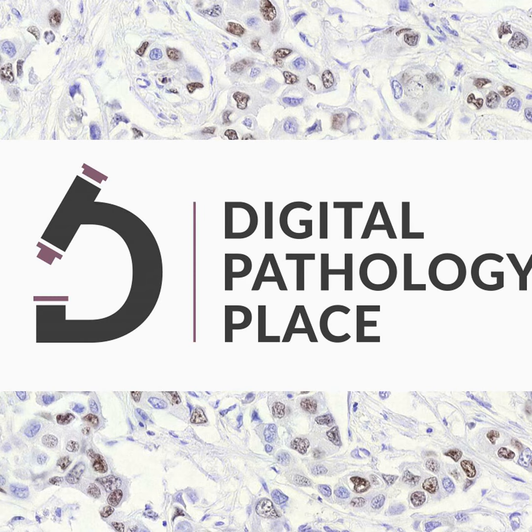So if there's nothing relevant to the mutation in the image, then it is very important to see how we predict these. Why? Because there's no information provided by the image to the viewer or even to the pathologist about this particular mutation. You do not always visually know that there is some feature. Colorectal cancer is a specific case where pathologists are describing different features. And there are also other publications that quantify what we see and describe, and see if it translates into any predictive properties of this image without even going into the mutational status, right?